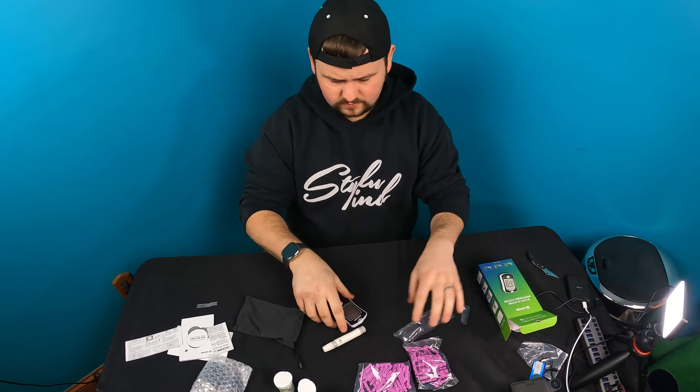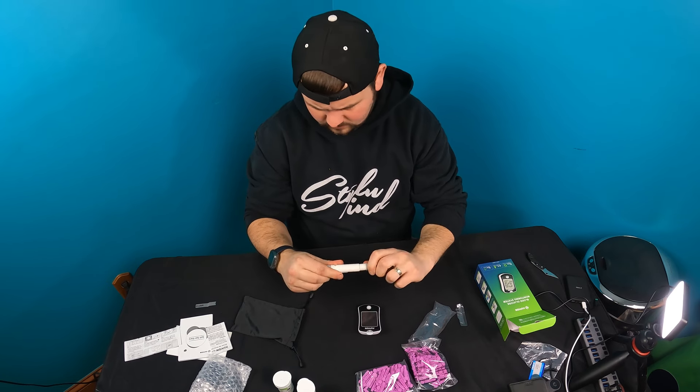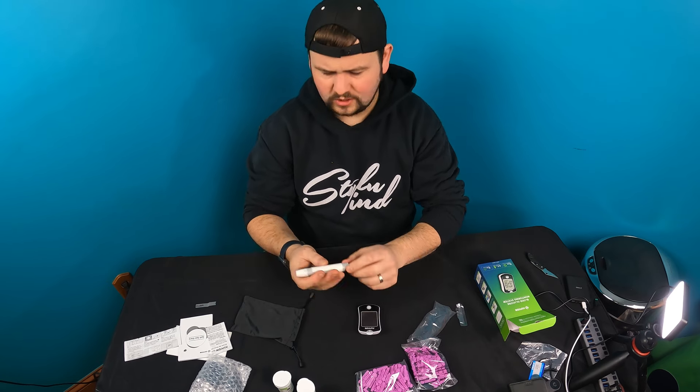Let me show you up close. This is where the needle goes, and this is your actual device — very small. Once you have the needle in, you pull this back, it locks in place, and you press this button and it pricks you. You can actually set the depth level as well.